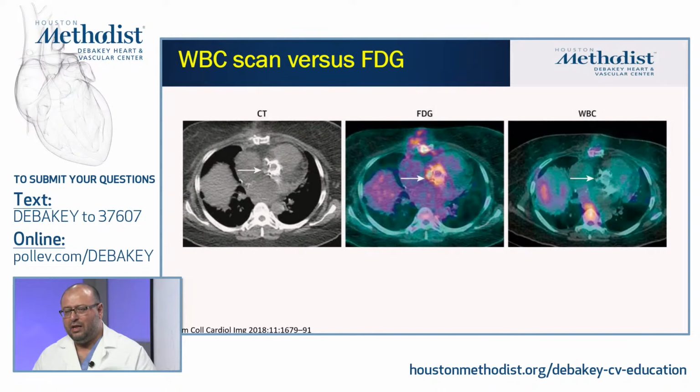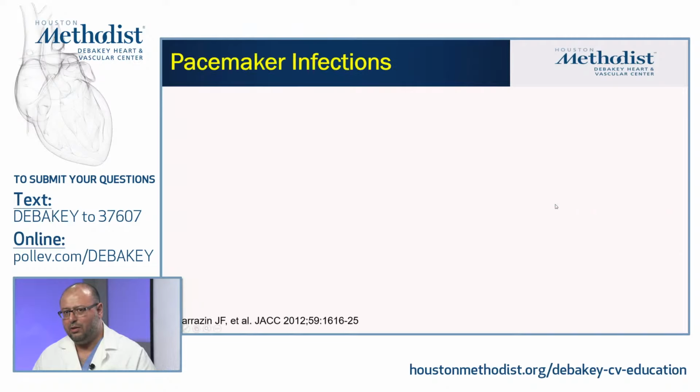A common question that always comes up is, how good is PET compared to tagged white blood cell, which is more widely available? Here's one case from the literature where white blood cell did not pick it up, but FDG PET had significant focal heterogeneous uptake, as is shown here with the focality of it. This was a patient who had endocarditis, but the main thing here is that it is more sensitive with FDG and more specific with white blood cell.